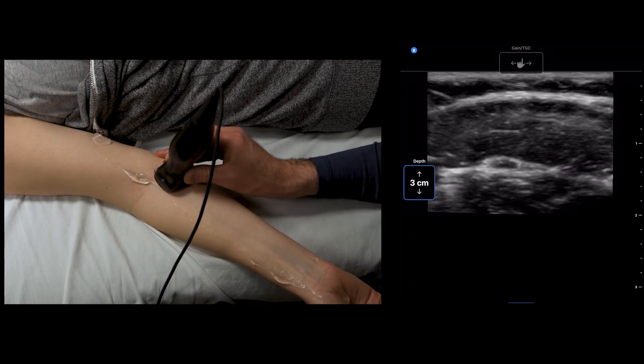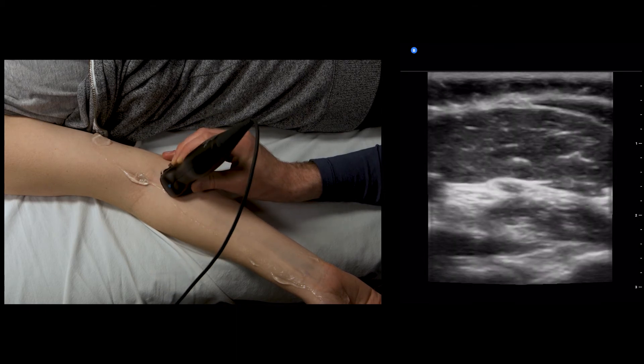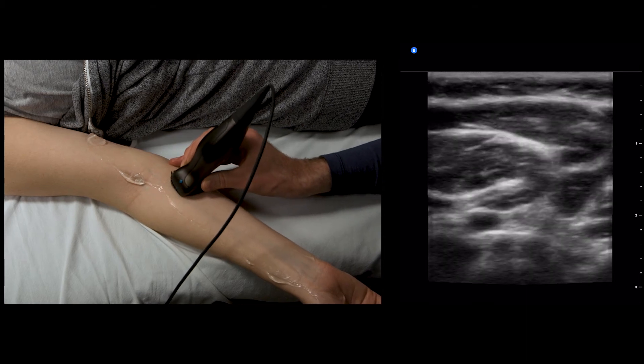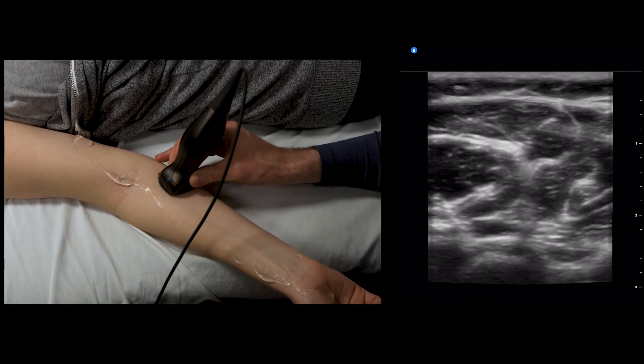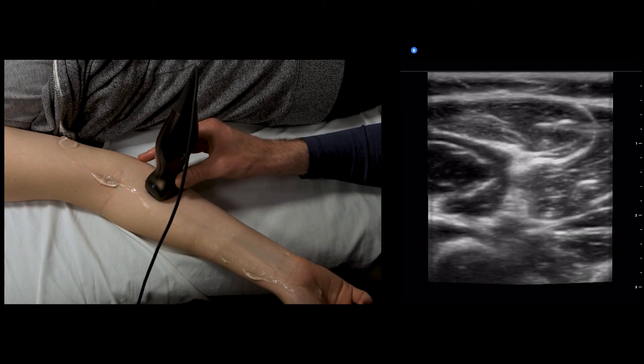We're going to adjust our depth. We're going to follow it down. Here it meets up with the artery again.